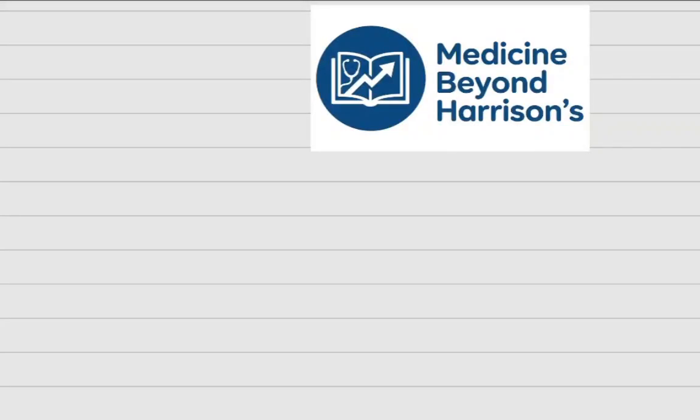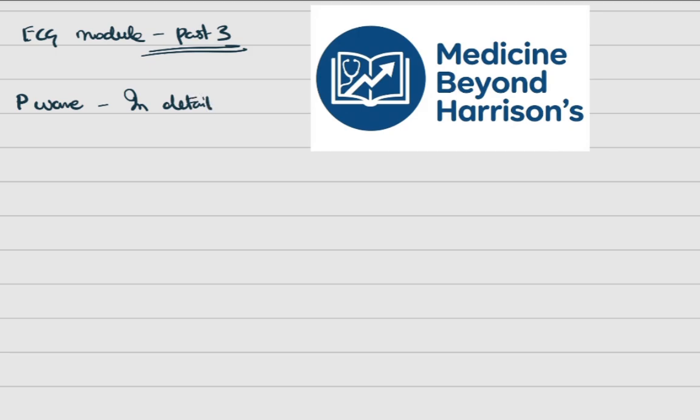On ECG module part 3. In this video we will discuss the P wave in detail. So we already know the P wave.